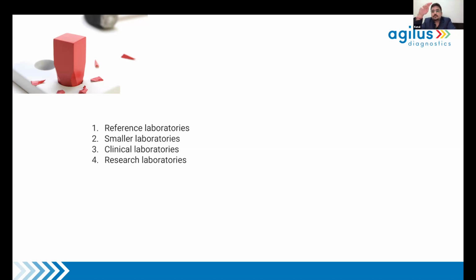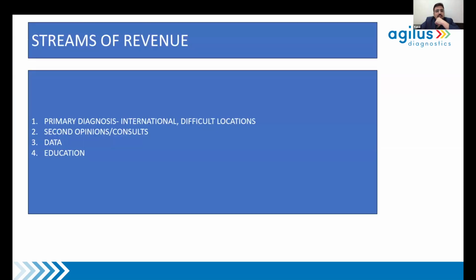So that is a place where you need your multiple slide scanners and your ultra fast scanners, which scan hundreds of slides. Similarly, when you're dealing with research laboratories or clinical research laboratories, which are dealing with drug delivery, you again need scanners which are robust and can scan hundreds of slides. So it's important for you to understand what you need digitization and AI for.